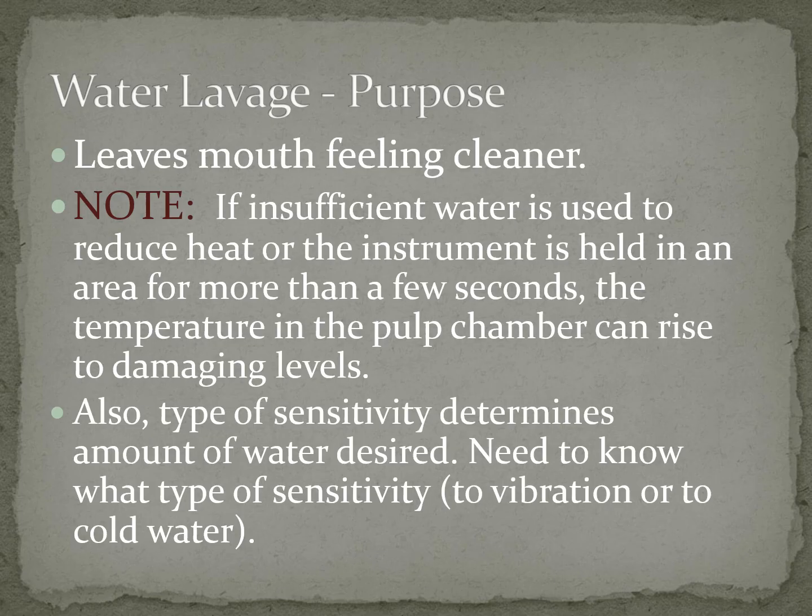Always make sure that your patient has water. So make sure that water is continuously coming out. So also the type of sensitivity is going to be determined on the amount of water desired. So you need to know what type of sensitivity your patients have. So is it sensitive to hot? Is it sensitive to cold? Is it sensitive to vibrations? And so that's going to make a difference on how you make that patient comfortable.